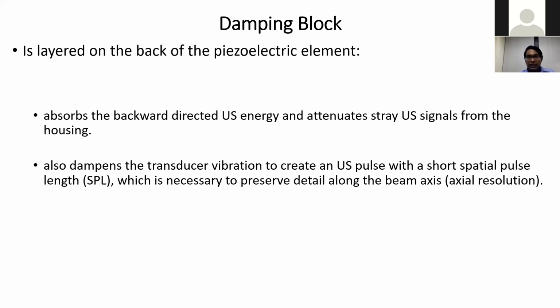It's vibrating radially and axially, and that creates a lot of unnecessary vibrations. We only want a directed vibration going into the medium. So any other energy needs to be absorbed by this damping block, and that's the role of the damping block.